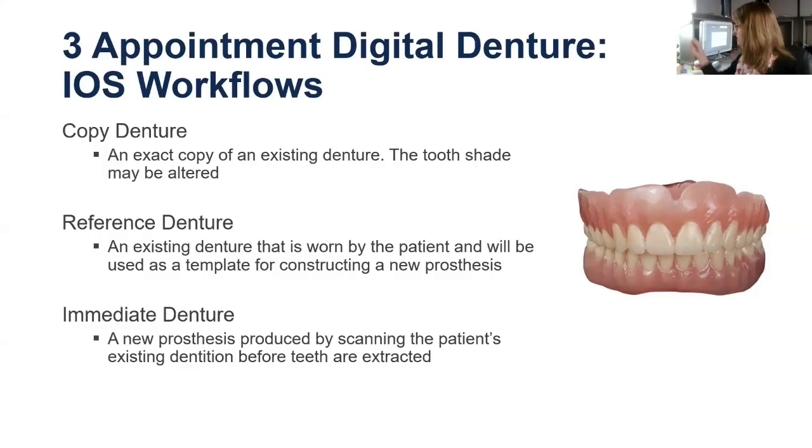So it is the patient that comes into your practice, and they have this denture. They love it. They love everything about it. They're going to be traveling this winter. They're going cruising, and they want to back up. They want a spare. That would be the definition of a copy denture technique, and we're going to discuss that in greater detail.